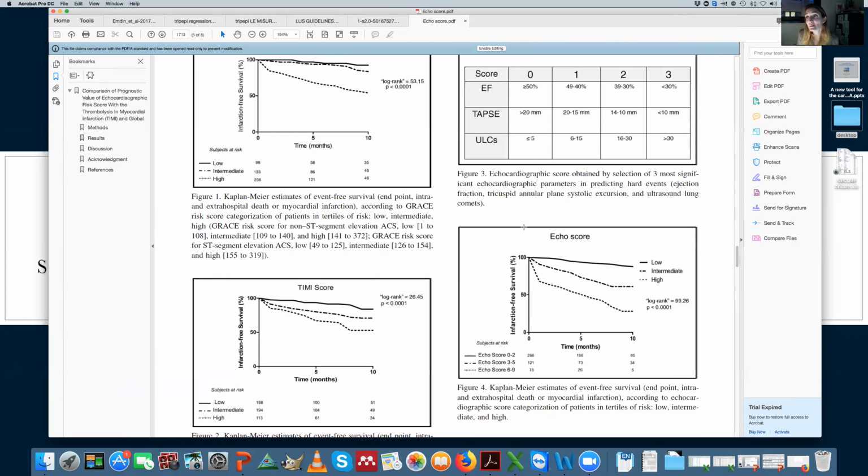So in these patients, monitoring the B-lines, even just at the beginning when they come in with the acute situation, can be very useful, because maybe you can give a little bit of furosemide that otherwise is not so typical to give to these patients, because you are concerned about the acute ischemia. And I have to say that in my personal clinical experience, this is really, really helpful.